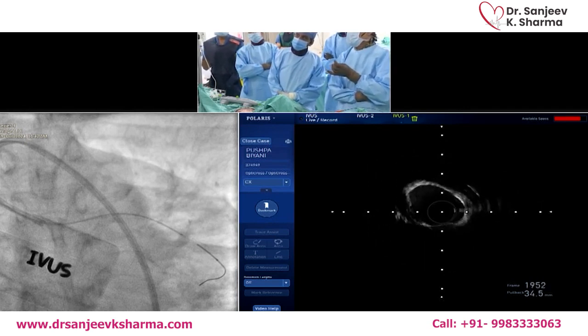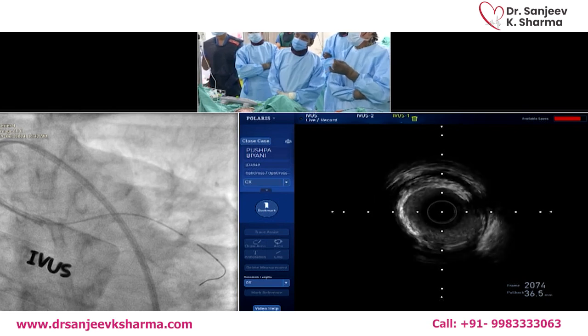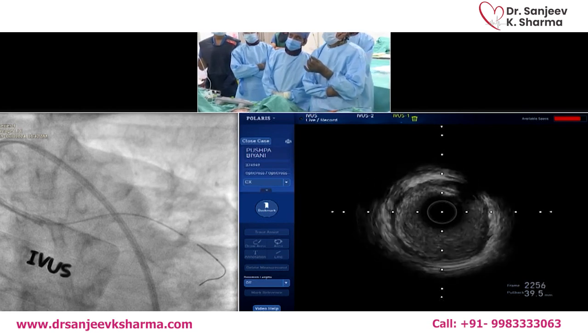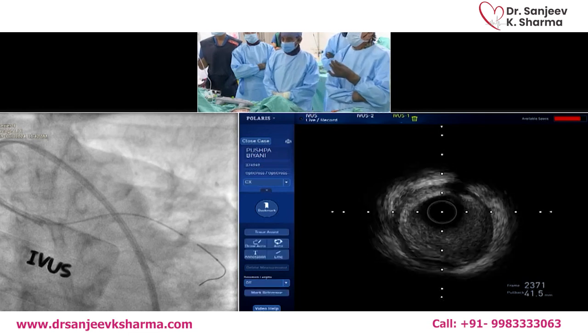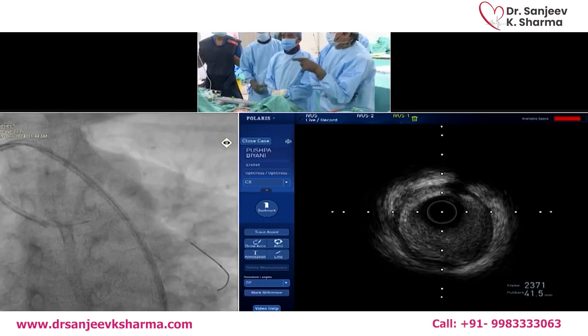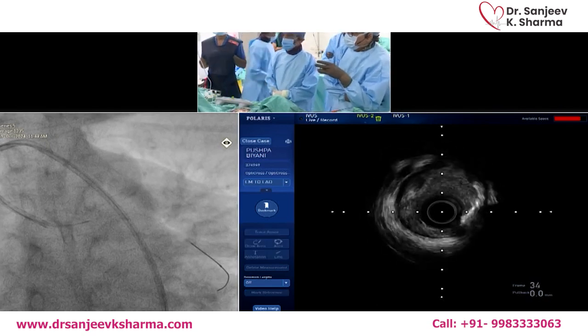Here you can see the circumferential calcium, close to 360 degrees or 270 degrees. Over here, everything becomes black behind the calcium because the calcium was so severe. Now we can see the left main body, which is a focal vessel, with focal calcium, not mild plaque. Now I'll show you a crescent between 10 and 2. LAD to left main pullback will give us clarity about the calcium in the ostioproximal LAD and also the distal left main.